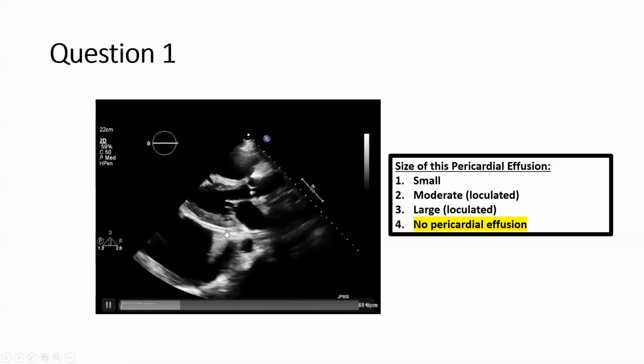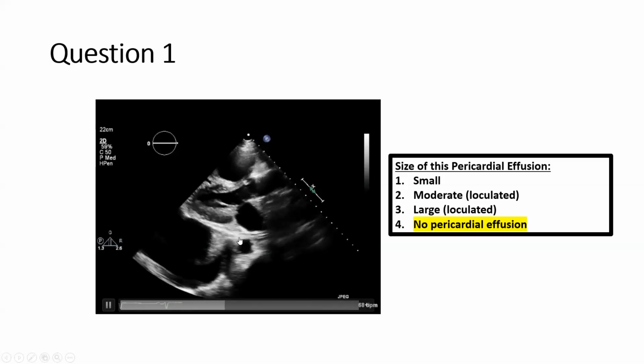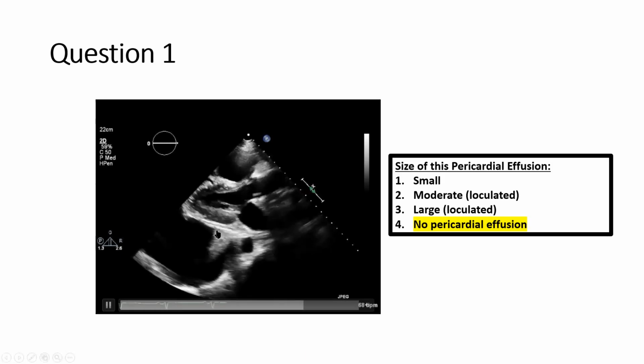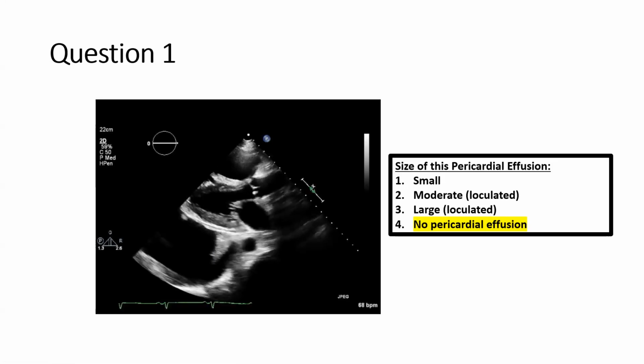Posterior wall, you can clearly see the line of the visceral pericardium and the parietal pericardium. There is probably a small amount of fluid. This is a large fluid space. It is clearly outside the parietal pericardium, outside the descending thoracic aorta. So this is a large pleural effusion. And if you look very carefully, you can see that the two layers of pericardium are moving with each other. So they're kind of tethered. They should not really move together. They should kind of slide over each other.